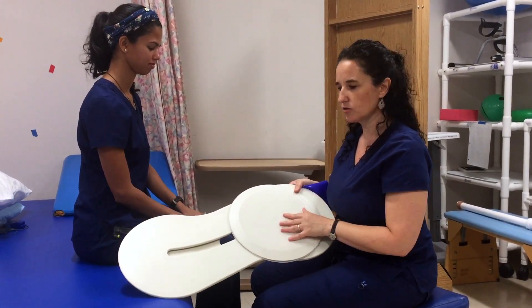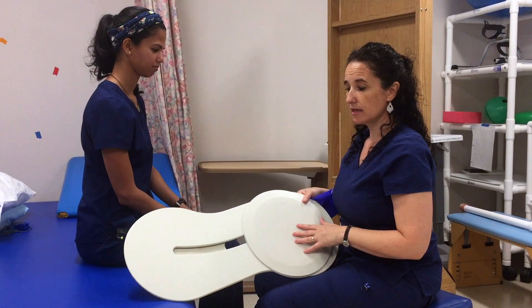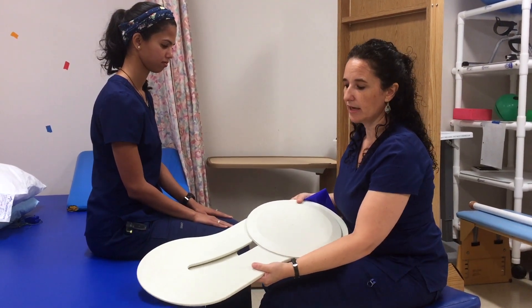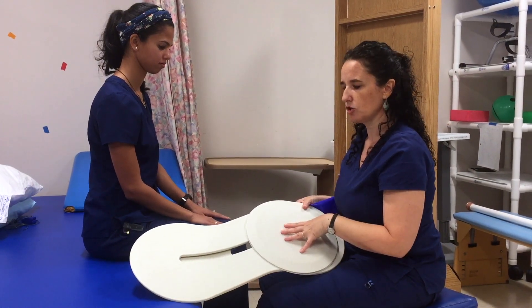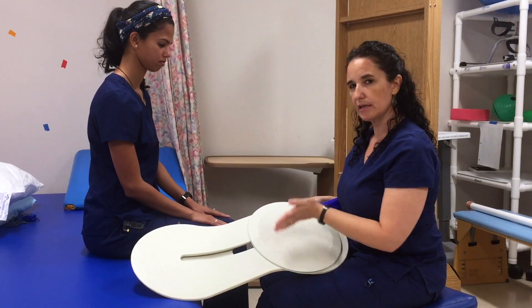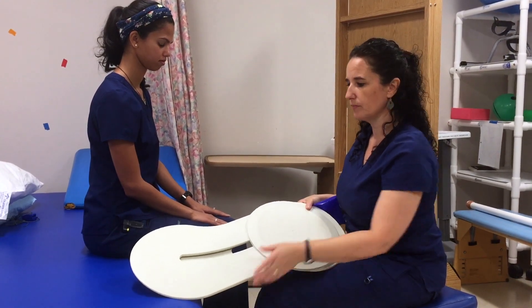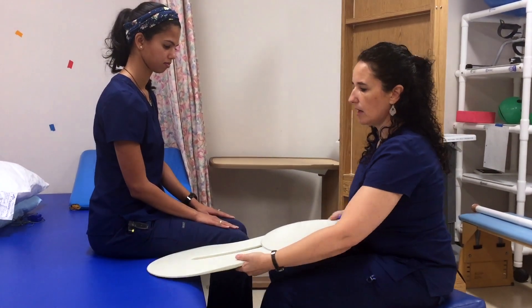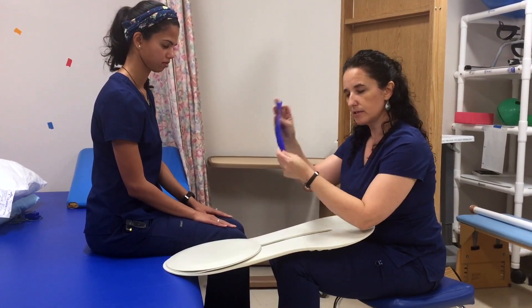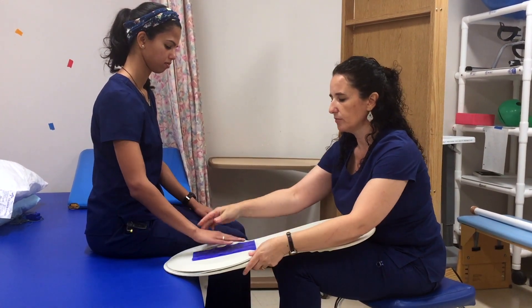Here's another thing I like to use — the BC board. As you can see, it glides, and we use it for the repetition and intensive practice of the upper extremity. I like it because you can have the patient follow a fixed direction when they're moving, so the arm is not all over the place and you have more control. I'll show you how to do it going forward and back for shoulder flexion. I put a little piece of Dycem so the hand stays in place a bit better.